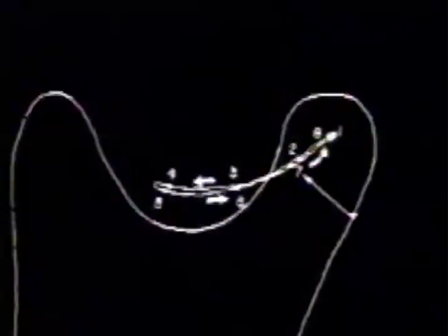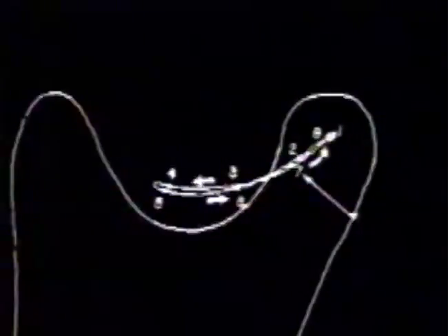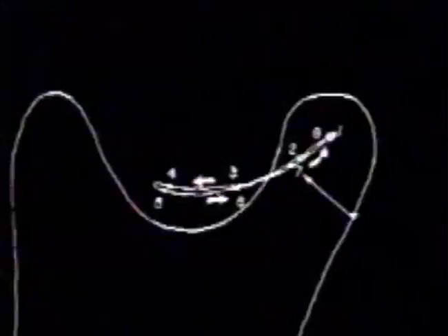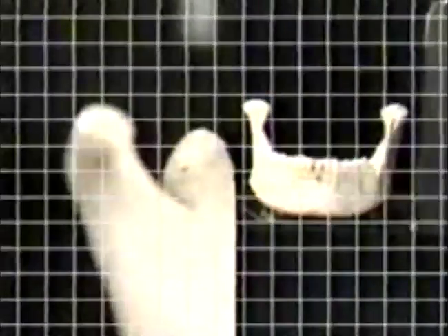Some authors feel that the non-working side is under a heavier load, and the thinner center part of the disc is interposed between the condyle and articular eminence throughout the opening and closing movement. Again, action of the non-working side condyle is shown in the split-screen simultaneous views. The subject is now chewing on the right side. The black dot is located on the non-working condyle.